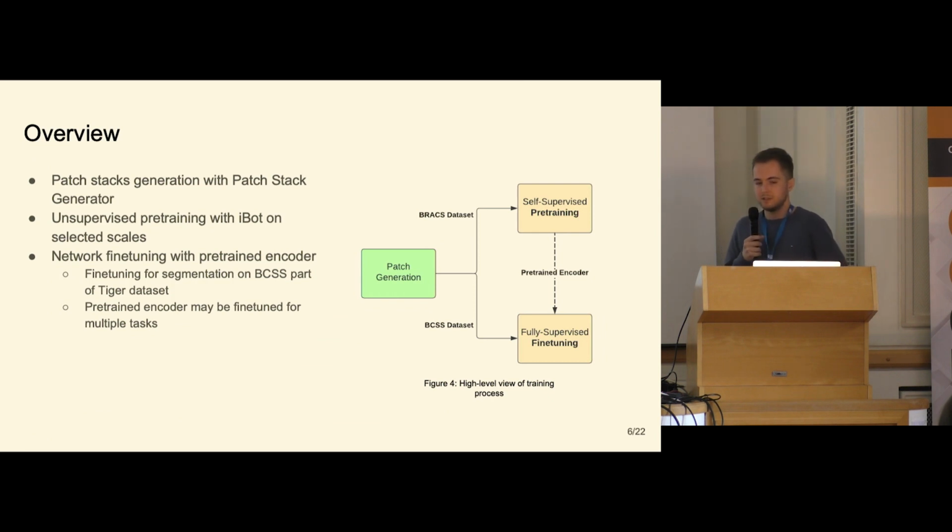We have chosen a semi-supervised method consisting of unsupervised pre-training and supervised fine-tuning. We process entire whole slide images at the input, and we process them using a patch generator. For the self-supervised method, we selected iBOT, which operates on the principle of masked image modeling and knowledge distillation, and we analyze its properties in greater detail together with learned features. And simultaneously, we explore the possibilities of using contextual information within the supervised fine-tuning part of our work.